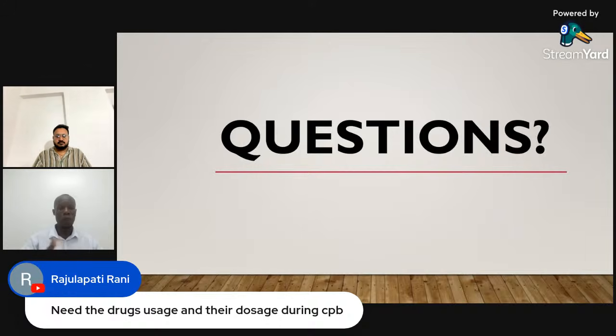After that, I need the potassium level and the calcium level to balance the normal blood electrolytes and the blood prime electrolytes. If it's not balanced, I keep on treating it until it is balanced. That's when I can proceed with the CPB. Okay, thank you. We'll go to the next question.